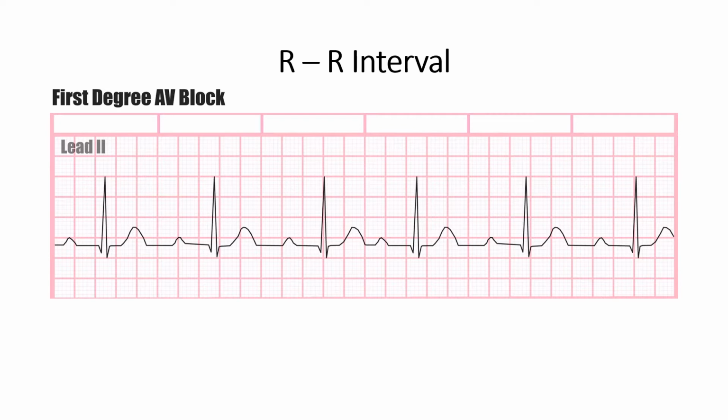So as we all know, this is P, that's your P wave. This is our Q down here. Excuse the writing, you get the idea. And this is the R up here at the top, right? Everybody remembers this.